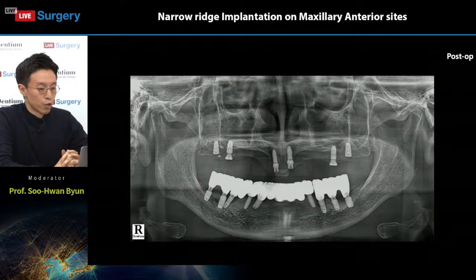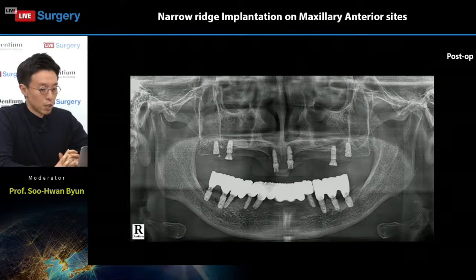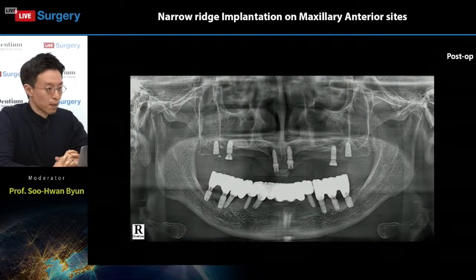We will show the post-operative panoramic radiograph shortly. We will now take a look at the post-operative radiograph. No problems are noted in this radiograph. Okay, let's summarize the case with this radiograph. Dr. Chung placed 2 implants at both incisor areas. He used the 3.5 Bright tissue level implant. The implants are well positioned as we planned.